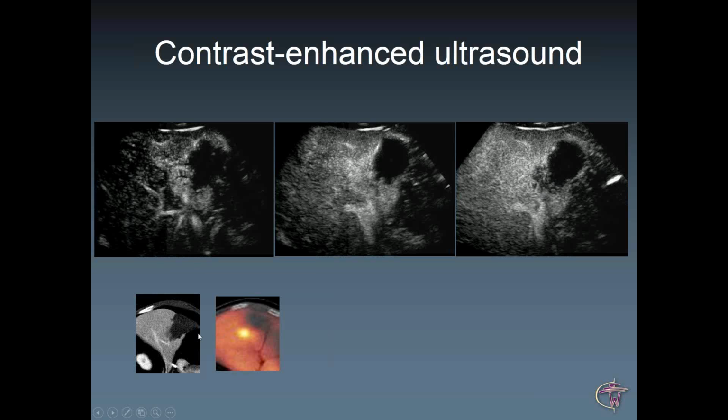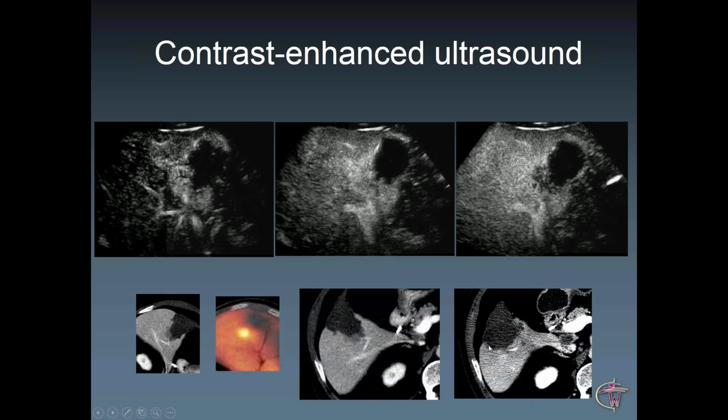These images are now 90 degrees rotated, so you have a better match and visual confirmation with the ultrasound image which was obtained intercostally. And then before and after the ablation, you can see that the zone here, which was a recurrent tumor, is ablated based on the helpful guidance with the contrast portion of the image here.